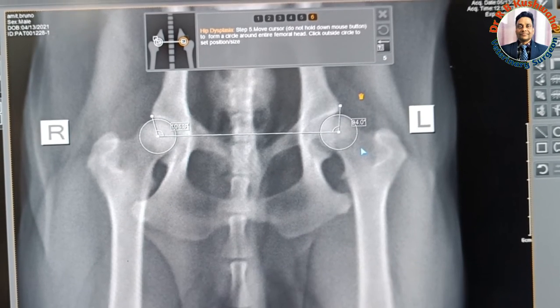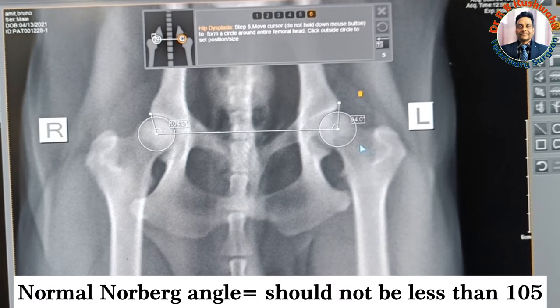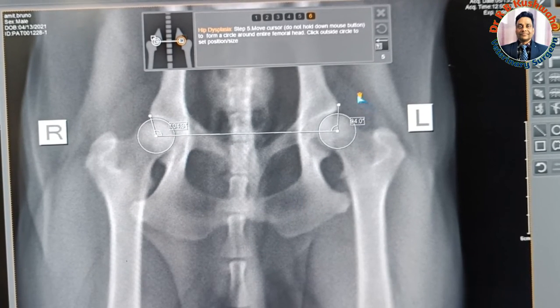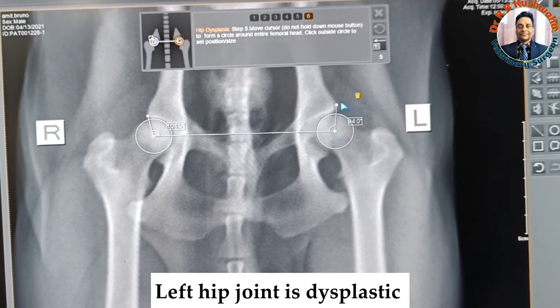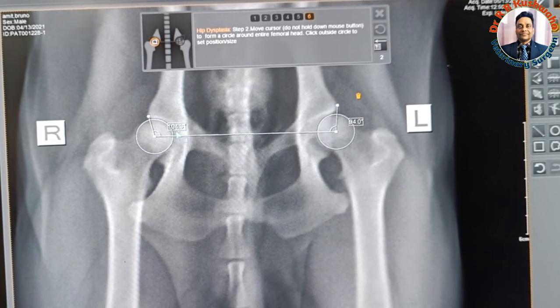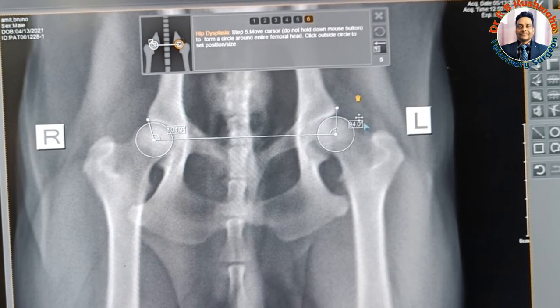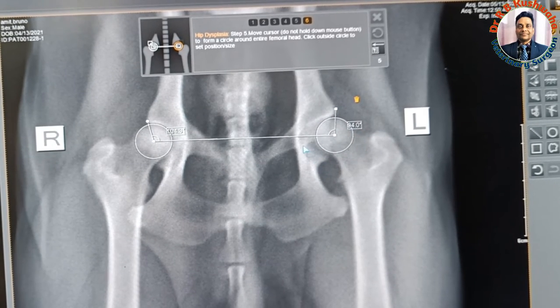Comparing with the normal value, the Norberg's angle should not be less than 105 degrees. So it means this dog is dysplastic, particularly the left side of the femoral head. Although the right side value is also less than 105, you can keep it as borderline normal. The dog is also showing lameness in the left hind limb.